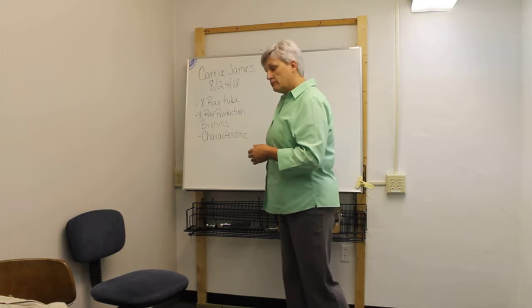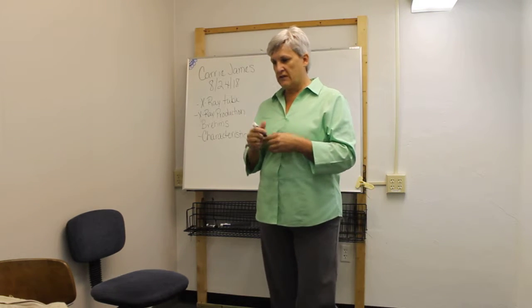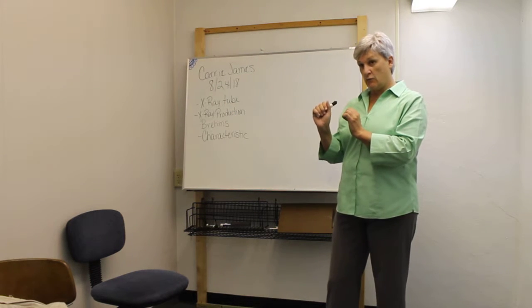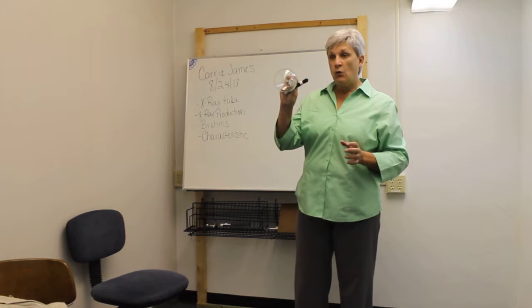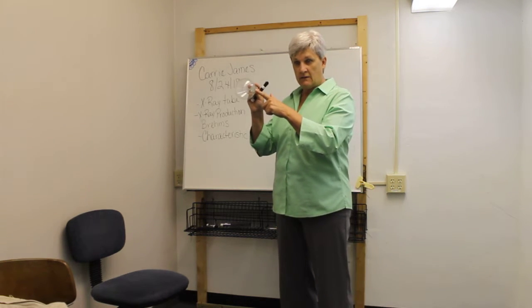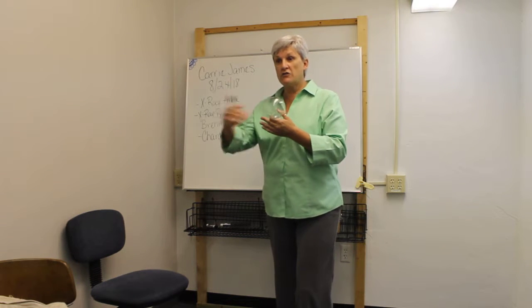So a little bit about this so that you can understand. We have the cathode side, which is the negative side, right? And on that negative side, we have a filament. Light bulbs have filaments. What happens when you put energy to this filament? It lights up. It lights up because electrons are flowing.